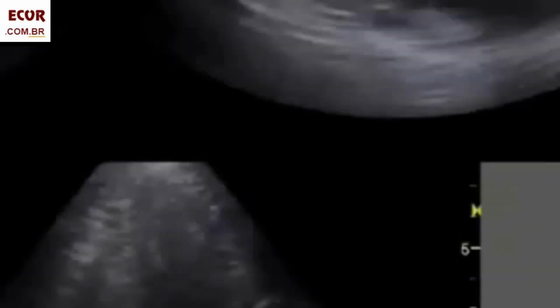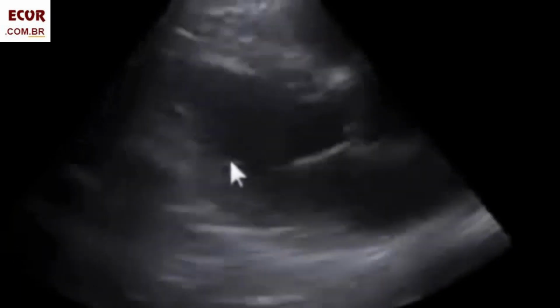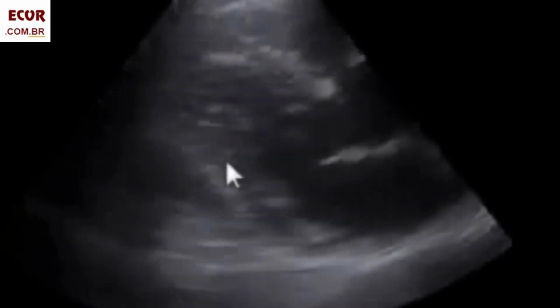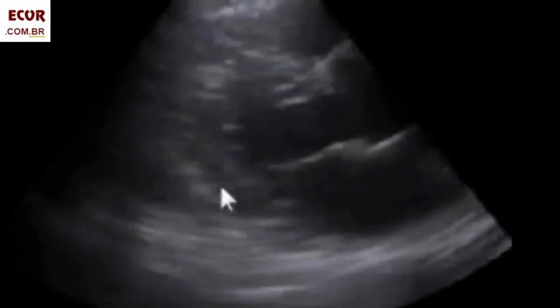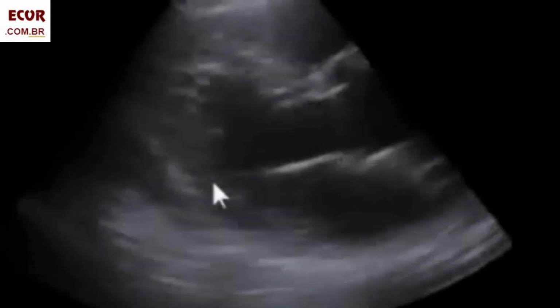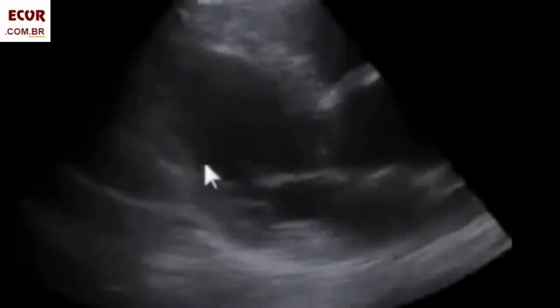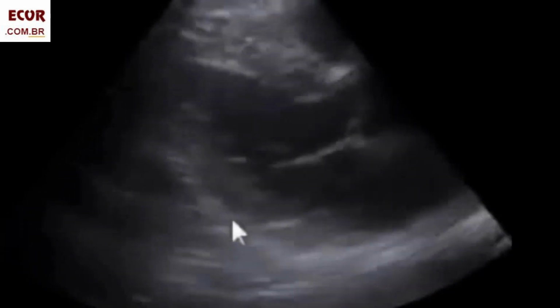This is a relatively frequent problem, usually in obese patients. What happens here is relatively simple. See how this wall moves extensively toward the apex. With the whole heart moving apically, our short axis may have the beam passing here during diastole, and as the heart moves toward the apex, we are then showing this wall here, more toward the base, and the impression that we will have is that this wall has expanded outward and it's dyskinetic.